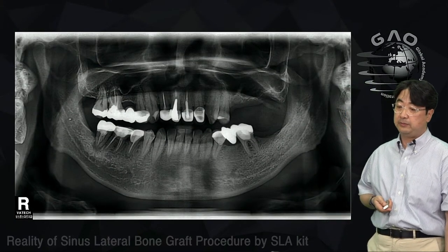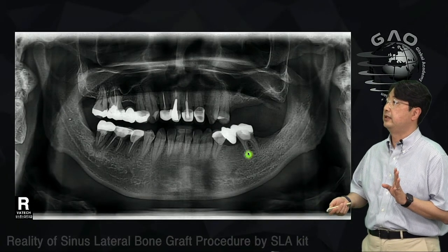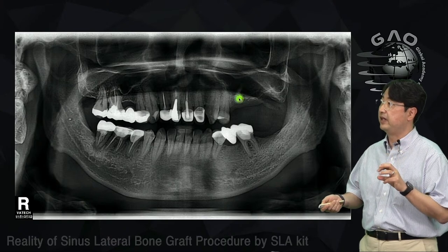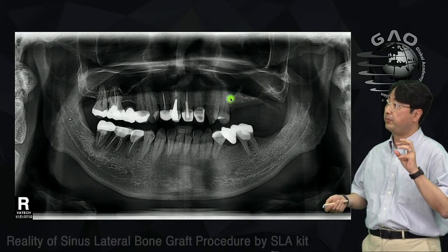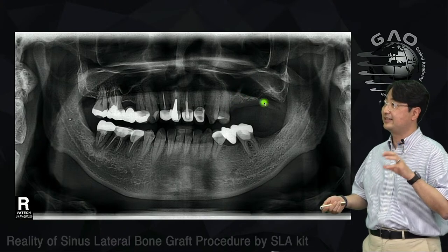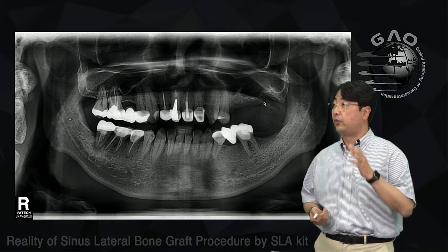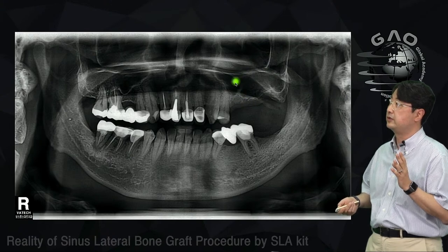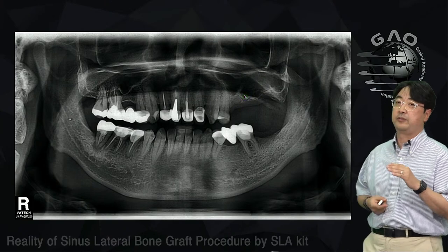Now I need to place implants. But as you see here, there is a septa right here. And you see there are different loops, right? So this septum divides two different parts. This part has a little bit of bone, but this part has less bone from the crestal area. So what I decided to do is the crestal approach for this front implant, and the lateral approach for this posterior implant.